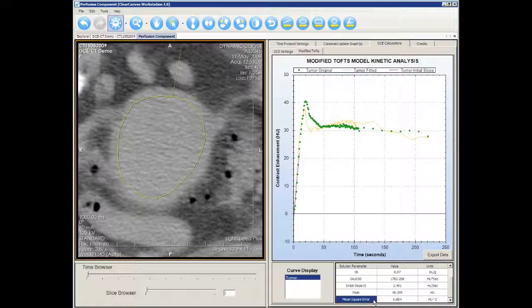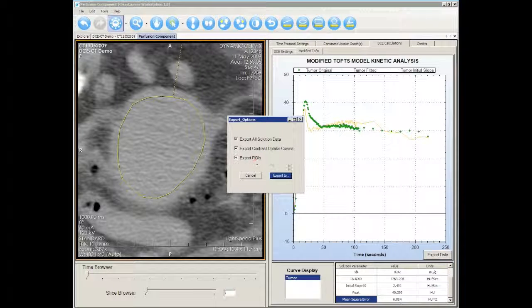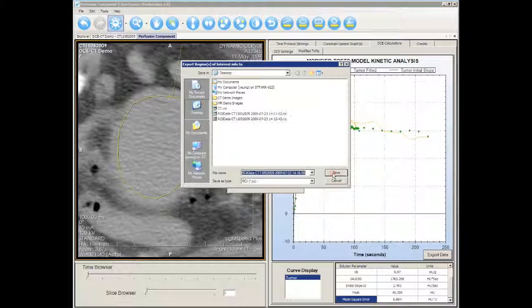The mean square error of the curve fitting is also displayed. Please refer to the website for the definitions of these quantities. You can export your results and contours by clicking the export button. Select the options and save your files.